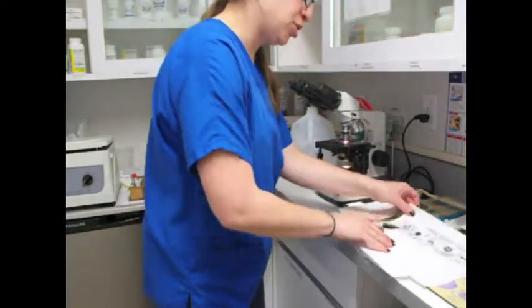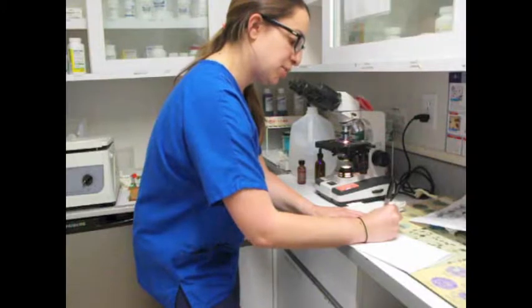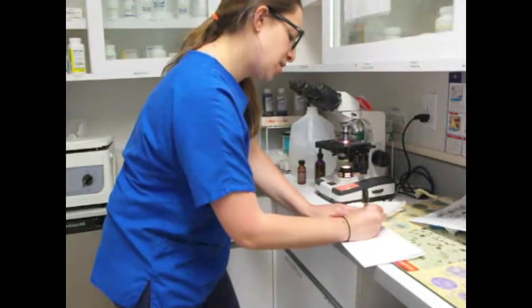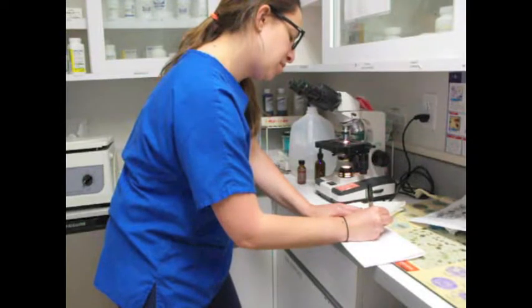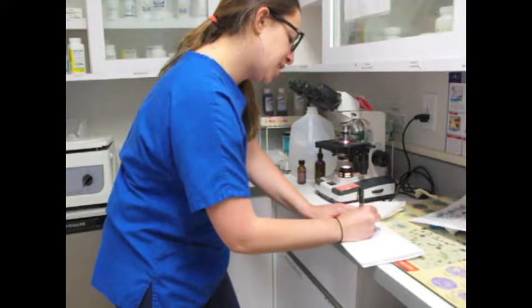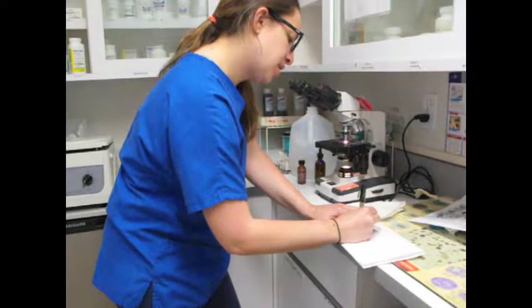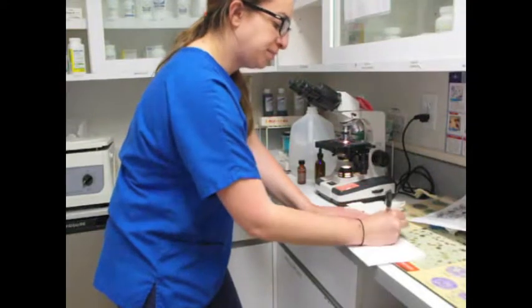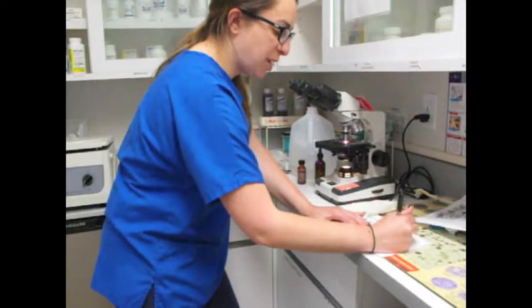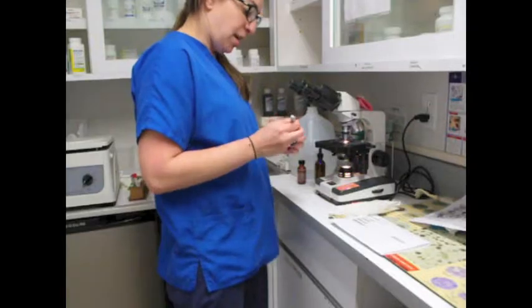So first what I'm going to do is just list some of my white blood cells here. Neutrophil, and then I'll just keep tallies this way. Eosinophil, basophil, monocyte, lymphocyte. Okay? And I'm just going to keep a manual tally. I'm also going to have my platelets over here, which I will get to after.